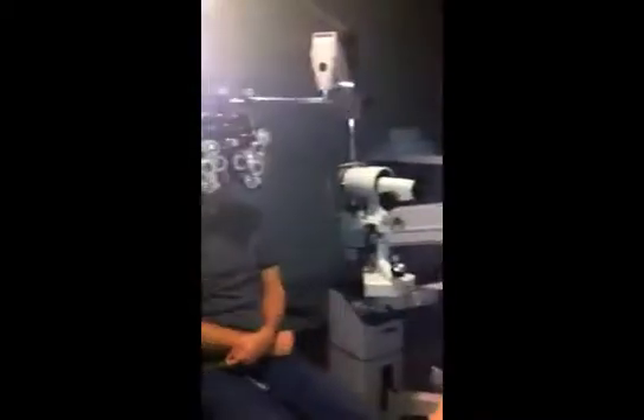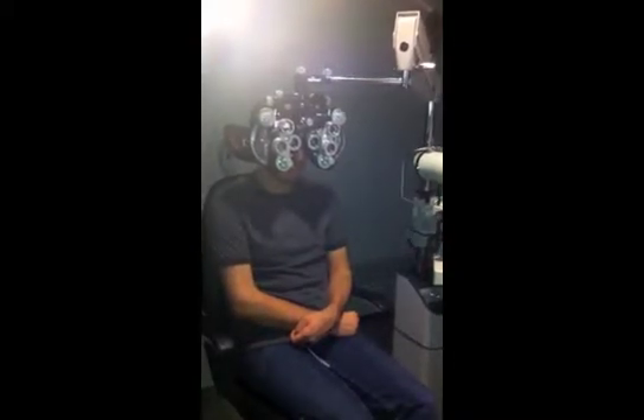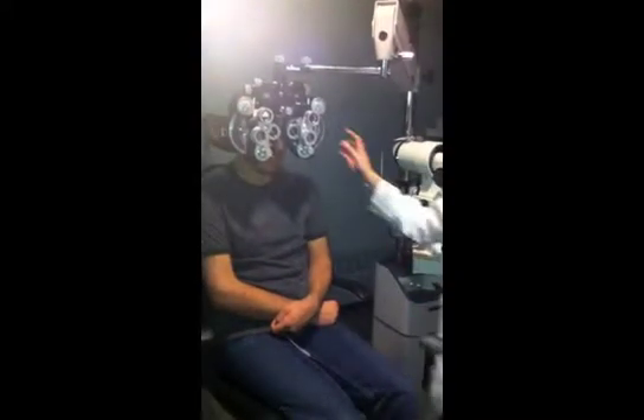Alright, here we go. It's 20/15. Can you read that line for me? I can just see it. C on the end, I think. Okay, and read this one for me. C, F, K, R, T, F.